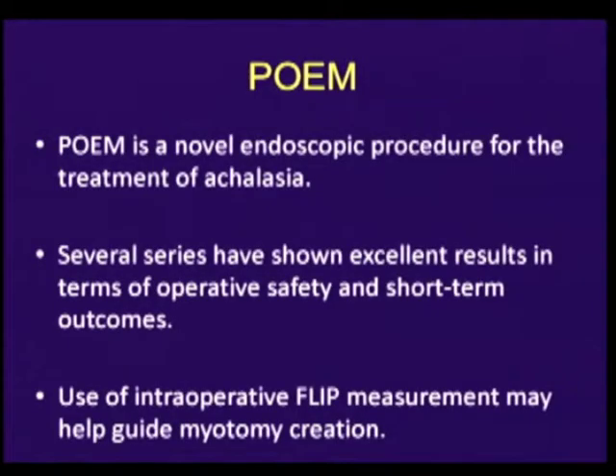Per-oral esophageal myotomy, or POEM, is a novel operation for the treatment of achalasia that creates a controlled myotomy across the EGJ completely endoscopically. Judging the proper extent of the myotomy in relation to the EGJ can be challenging during POEM. During our series of 42 cases to date at Northwestern, we've used intraoperative FLIP to quantitatively assess myotomy effect.